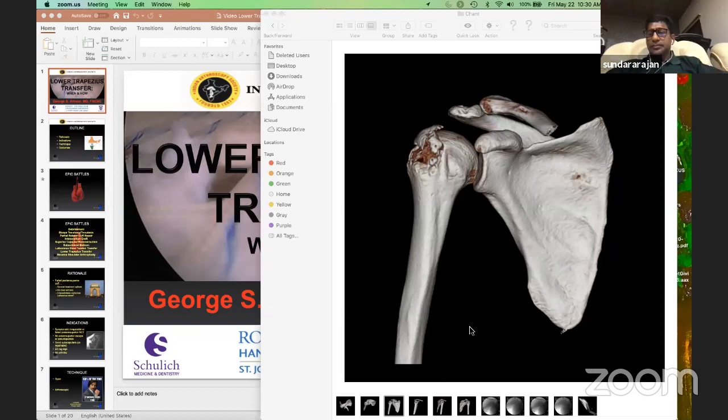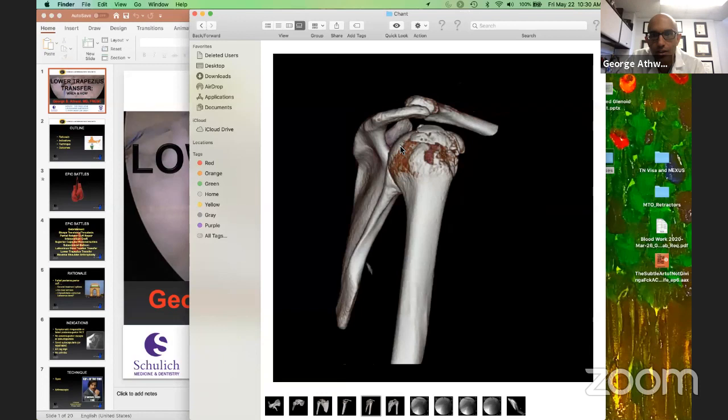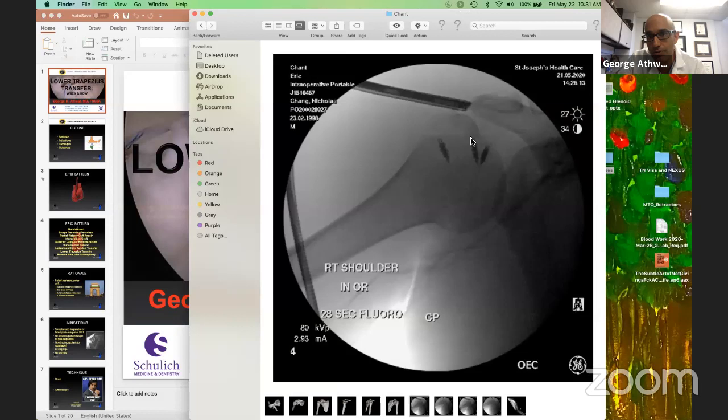This is funny. This is the case that I did yesterday. So 22 years old, comminuted tuberosity piece right here, multiple fragments right there. And I did the same. I use fluoroscopy always. And these are going in through the cartilage. And you can see that. And then I don't want to tie them too tight, because if I tie them too tight, sometimes I feel the piece gets too hard and I can't manipulate it. So then I agree that I have to tie them, and then I just loosely bring them over. And I got two peek knotless anchors down here. So five anchors, did the axillary nerve, and also fixed the Bankart too.